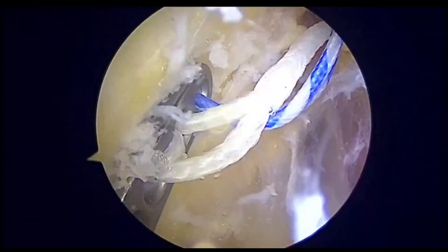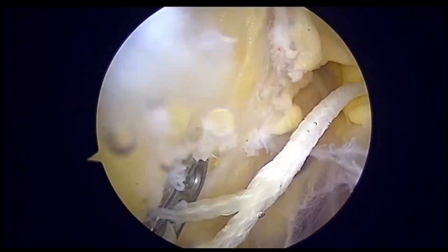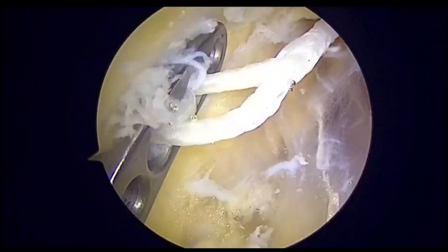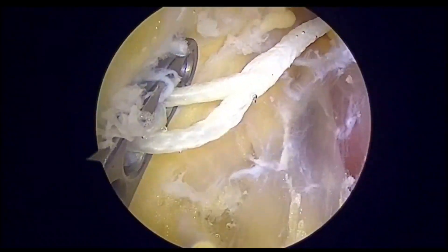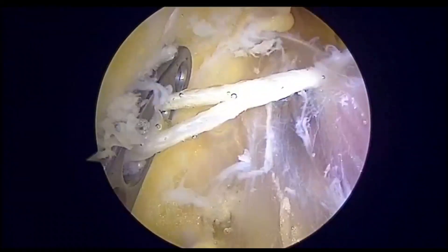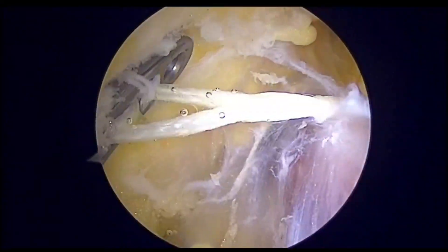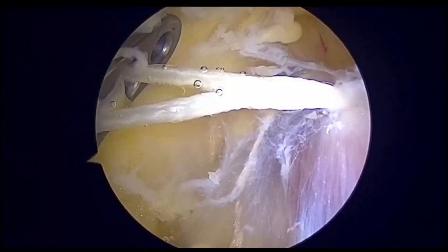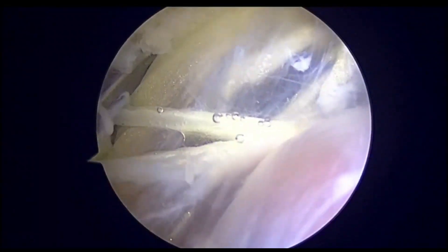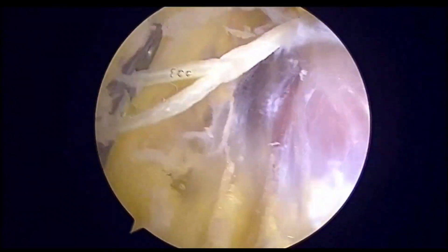At that point we can remove the white and blue sutures, and then cut the white suture. The V-shape that has been made represents the shortening of the loop gained with this adjustable loop device. Overall, it is a very nice innovation over the standard fixed loop or adjustable loop button, as we get the advantages of both the fixed as well as the adjustable loops.